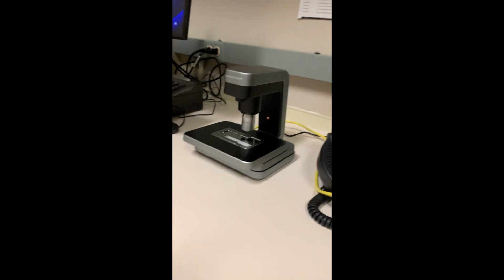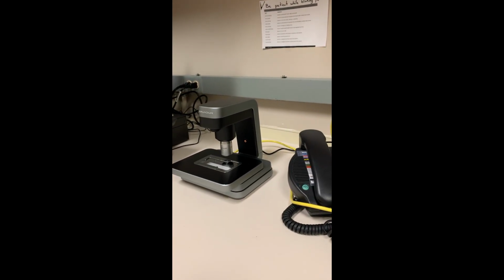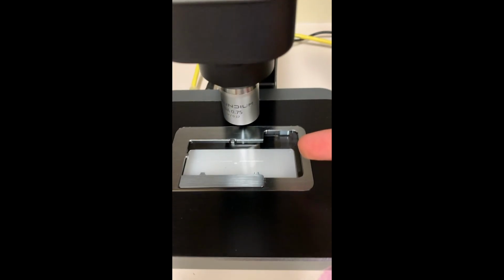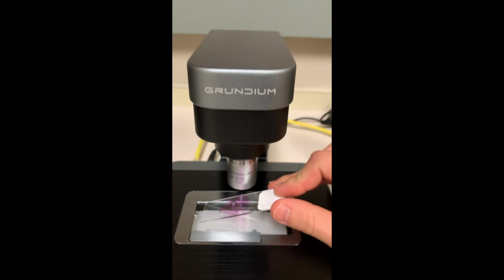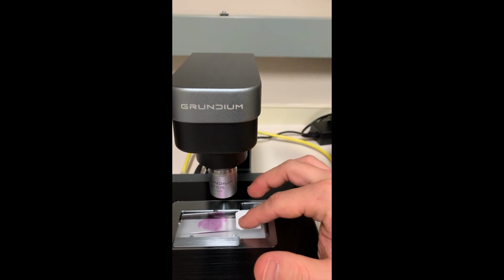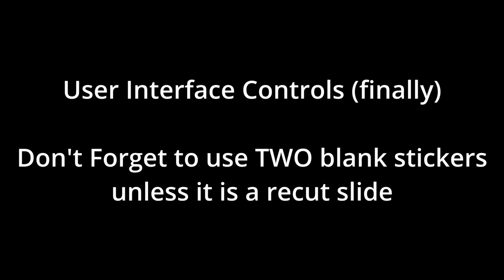So the tray pops out. Then if you were to input the slide, you could start scanning. So I'll just go ahead and do that. So doing this while filming, but you want to be very careful that you don't get your fingers onto that slide tray. So I will line it up so that I go against one edge and I get very close, and I actually just let it fall. And then I can give it a nudge if I need, but the tray will actually close and put it into the right position.